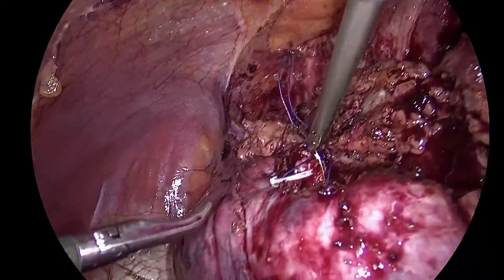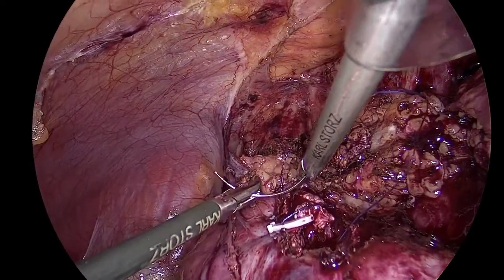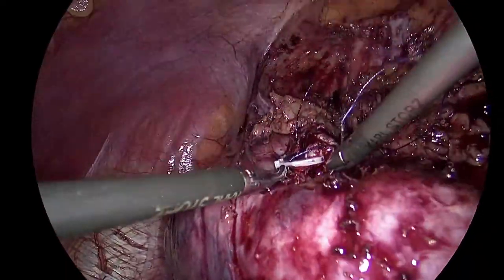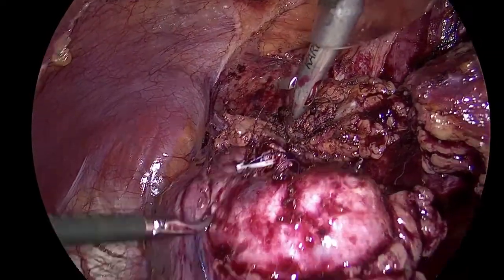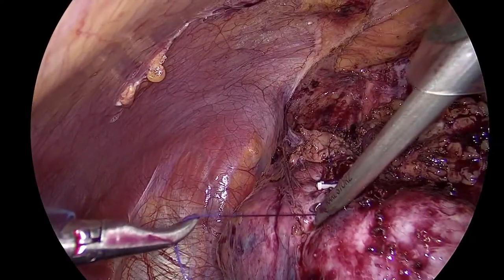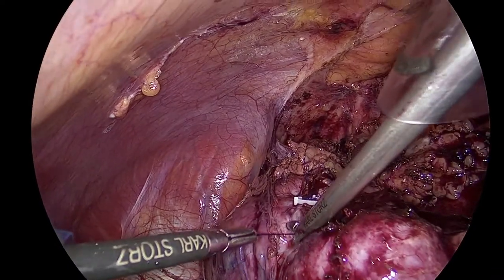Change the angle of the needle. In laparoscopy, you need to change the angles of the needles, and you don't have this advantage as you have in robotics. Prepare the clip, please. Here it's important to come in with your needle holder, to push, then you grasp it like this, come in closer, and you prepare your feel for the clip, okay?